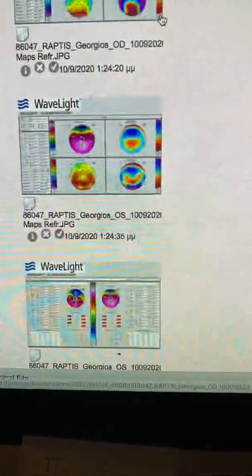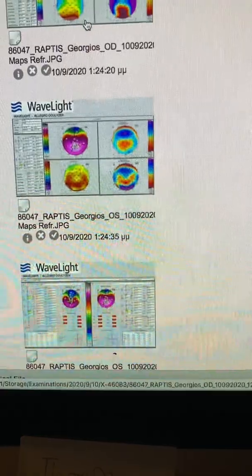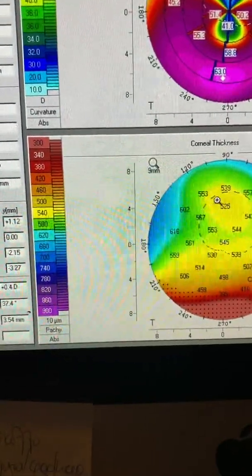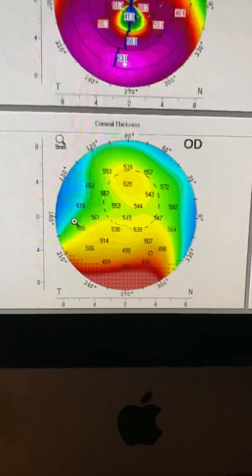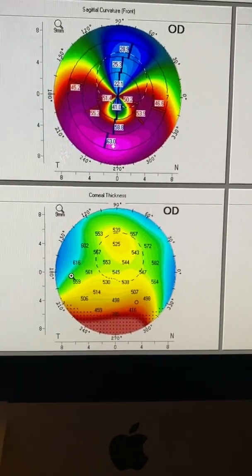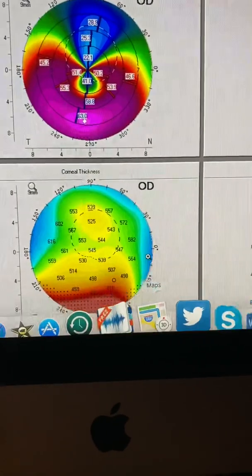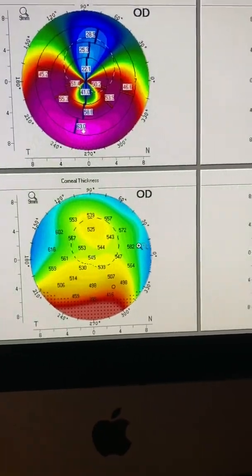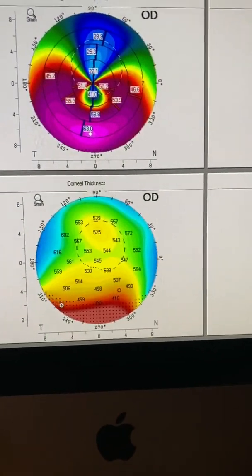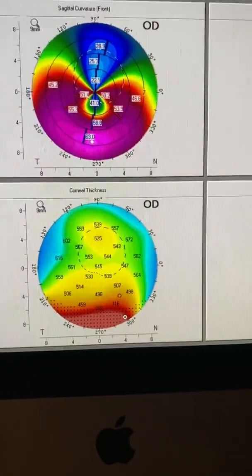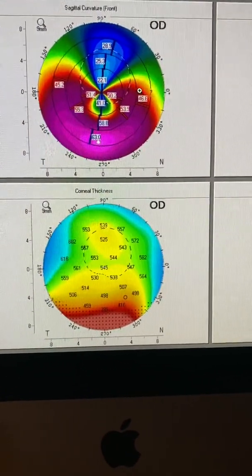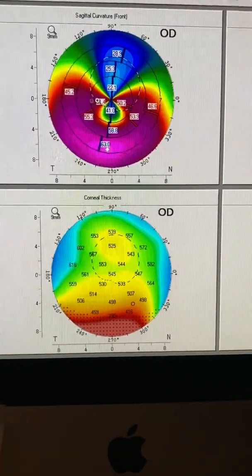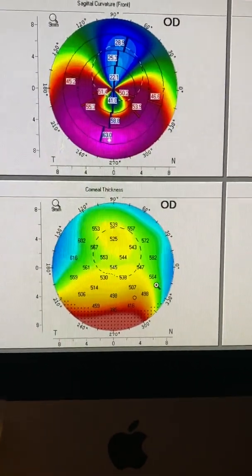But the task here is that we need to cross-link this very peripheral cornea and not the central cornea. So we're going to use the Peschke Mosaic device to design a broad area of cross-linking here, deliver a lot of energy in order to penetrate the cornea here. And yes, this could be combined with a topography-guided or even wavefront-optimized because centrally the astigmatism is very regular.